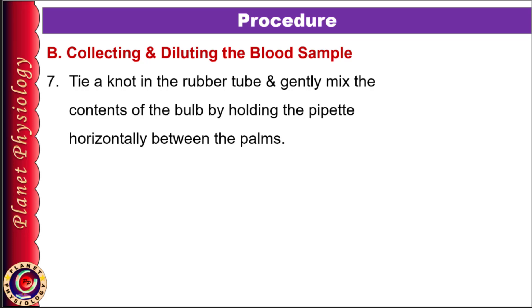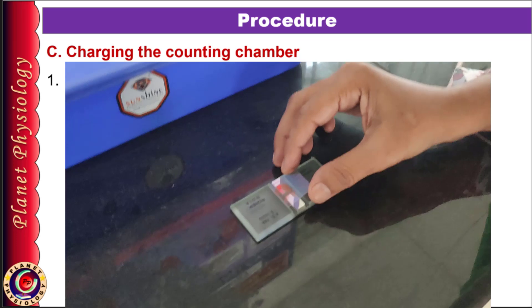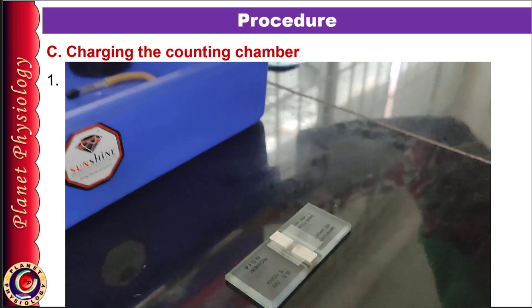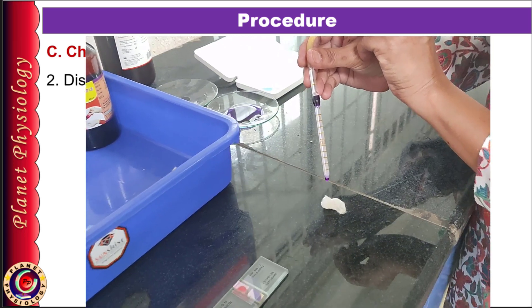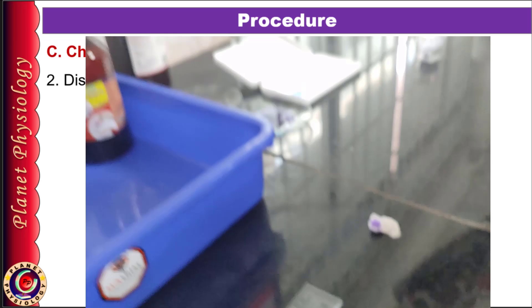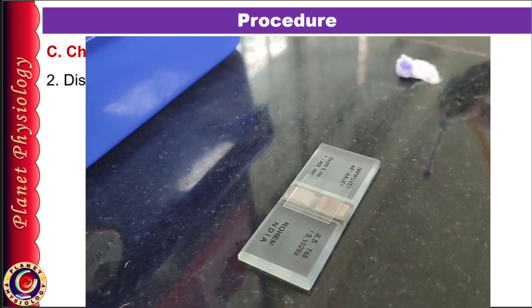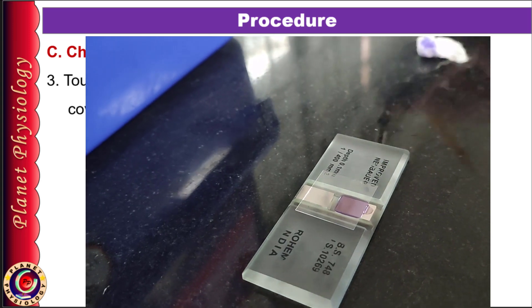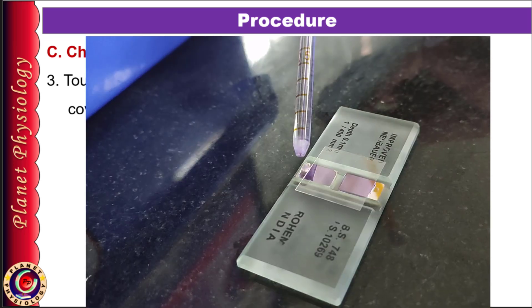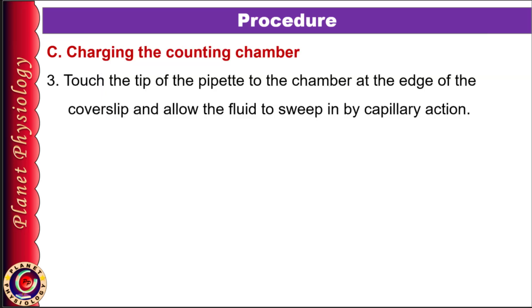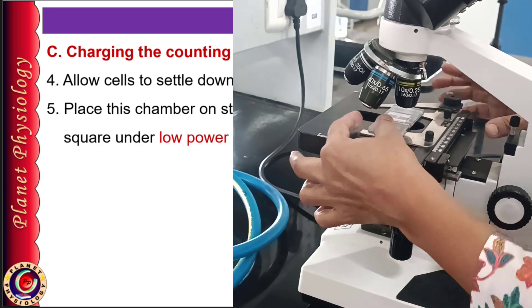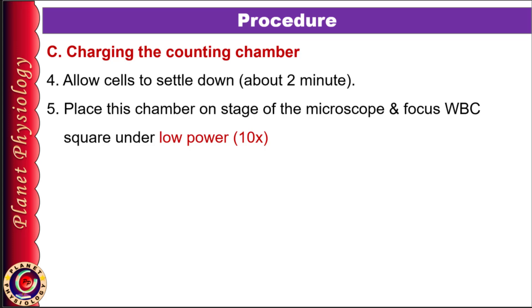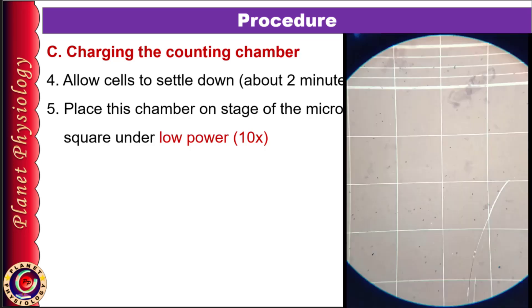This completes your preparation of the blood sample and you are ready to perform the cell count. To charge the chamber, place a clean coverslip over the Neubauer chamber — it should cover both counting surfaces and the side gutters. Discard the first two drops from the pipette, then allow a small drop to form and touch it to the chamber's edge near the coverslip. It will immediately sweep under the coverslip by capillary action. Wait a minute for cells to settle, then place the chamber on the microscope stage. Since it is already focused under 10x, you will only need fine adjustment to visualize WBCs.